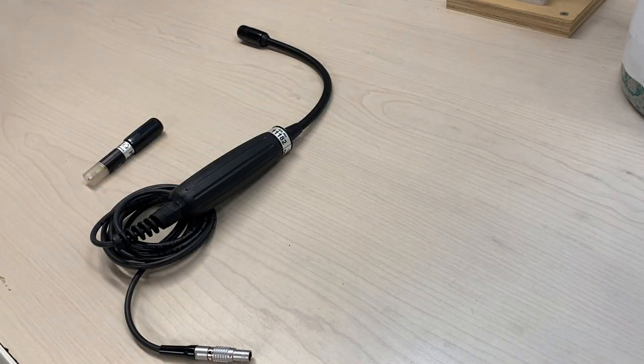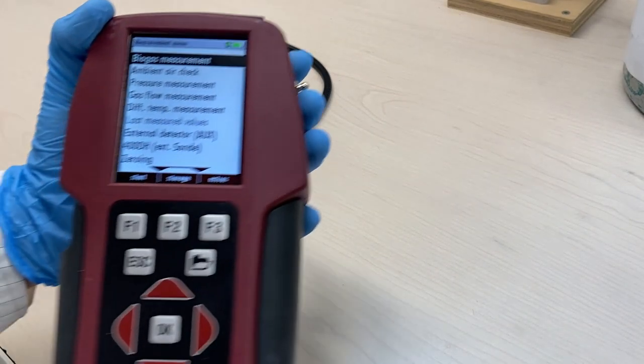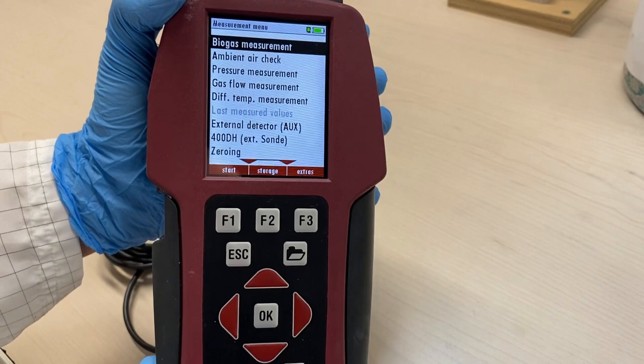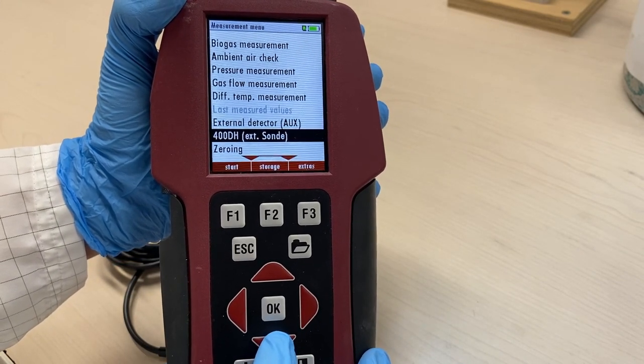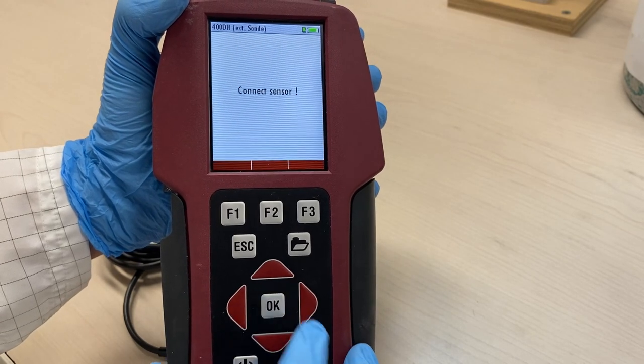After powering on the instrument, the main screen will be displayed in the window. Scroll down the menu to 400DH and click OK on the keypad.